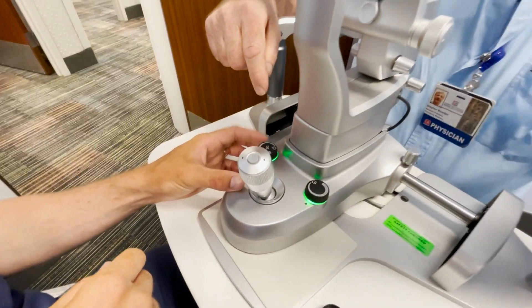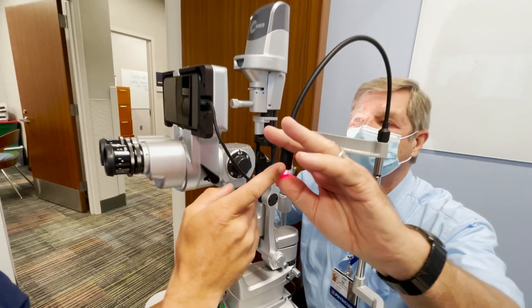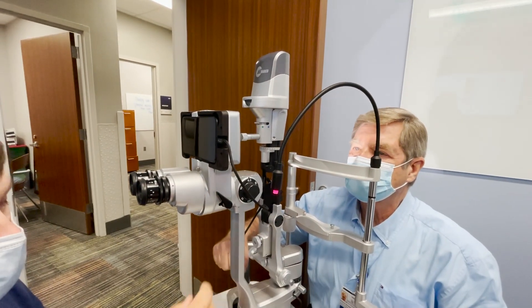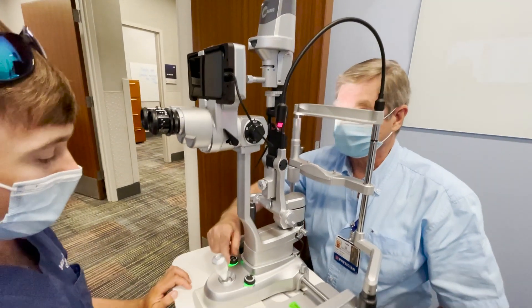This light provides an area for the patient to look at when you're examining their eye. If you want them to look somewhere specific, this is actually a separate fixation light.